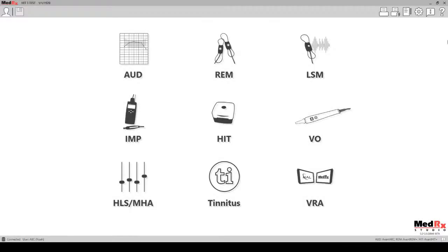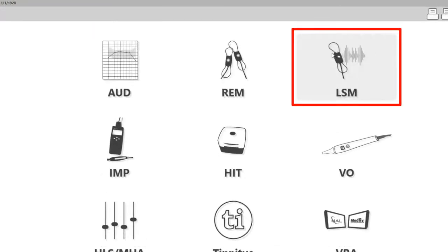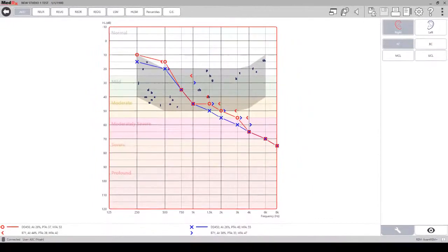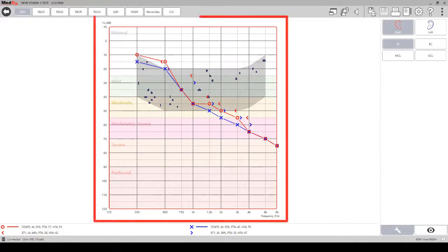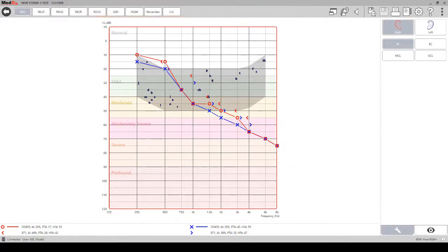To begin, you will want to click on the LSM module within the Medrex Studio software. Before you begin running measurements, you want to make sure that you have all of the frequencies plotted on the graph for the right and the left in order to display the targets properly.